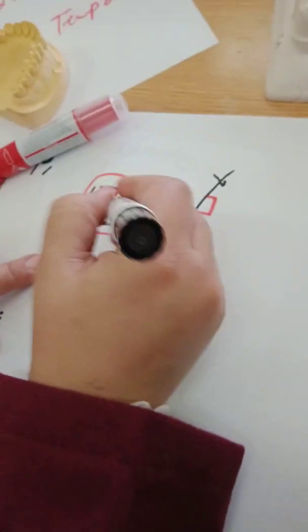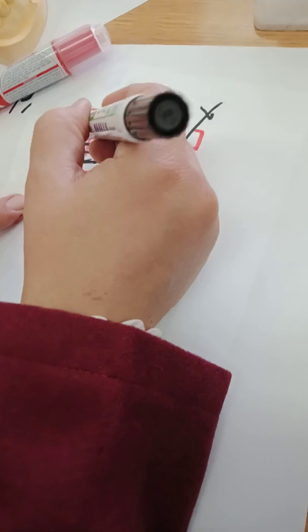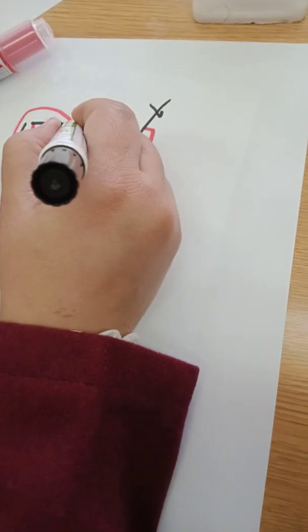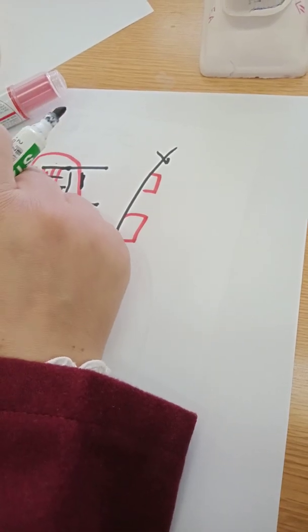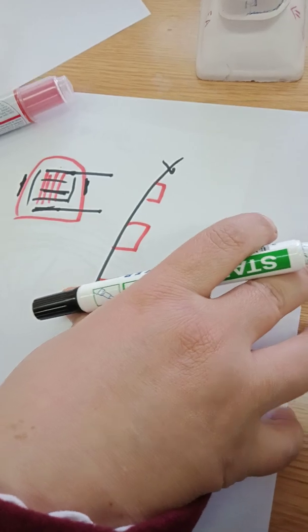When I open this leaf, I'll see these parts differently and I'll compare my preparation, because sometimes going gingivally, I don't prepare correctly. And sometimes when I go proximally, I don't prepare correctly. I'm not reaching the contact point, by the way, but still, when I go close to the contact area, I'm not preparing enough. So it will tell me on the sides of it. So that is when I need this preparation index.